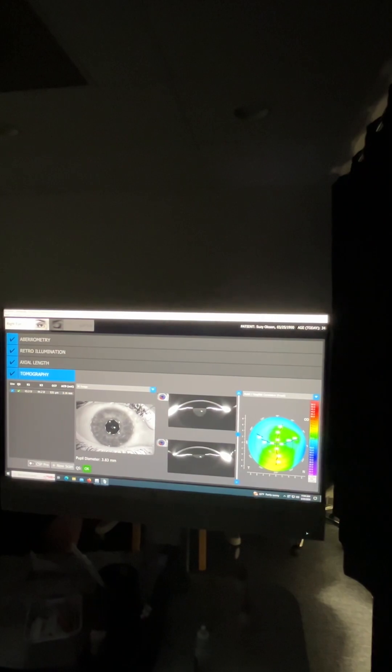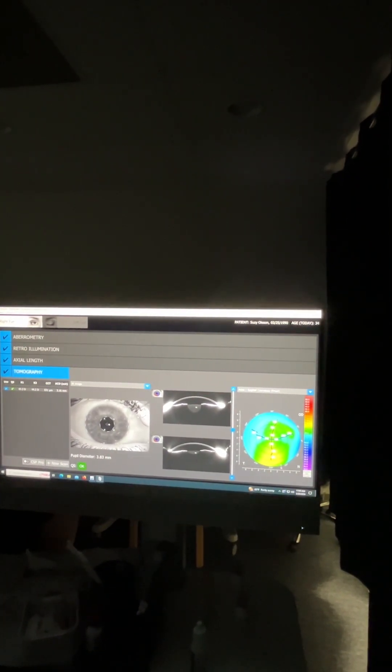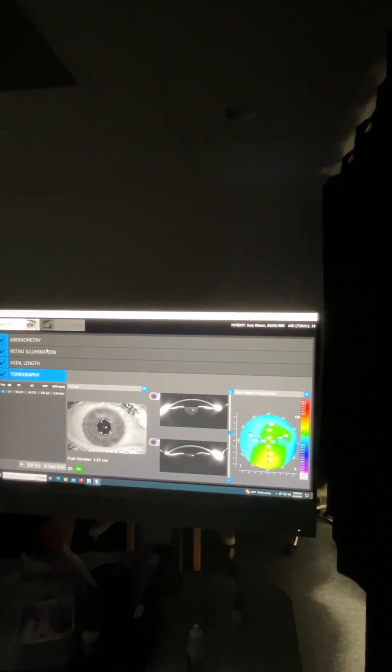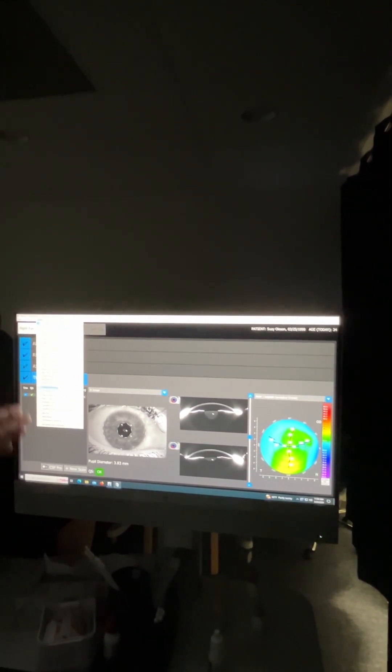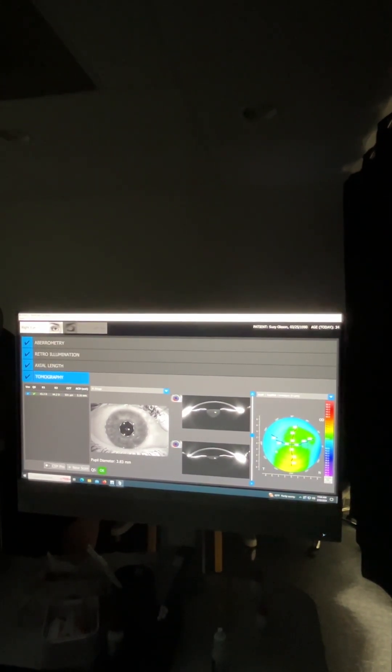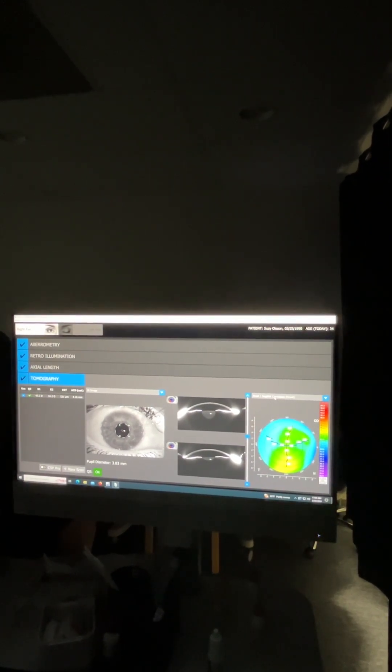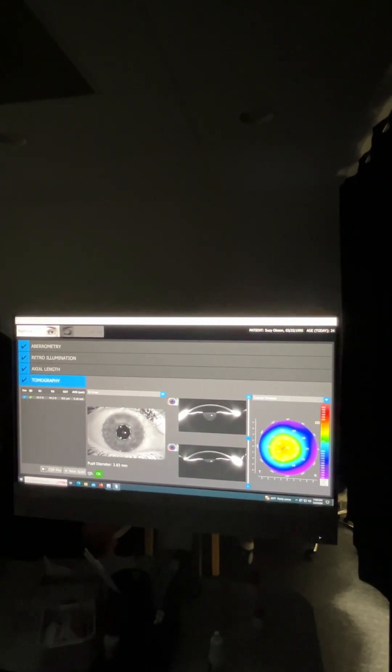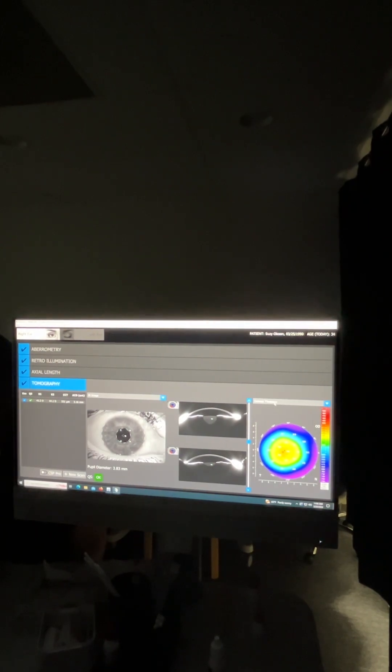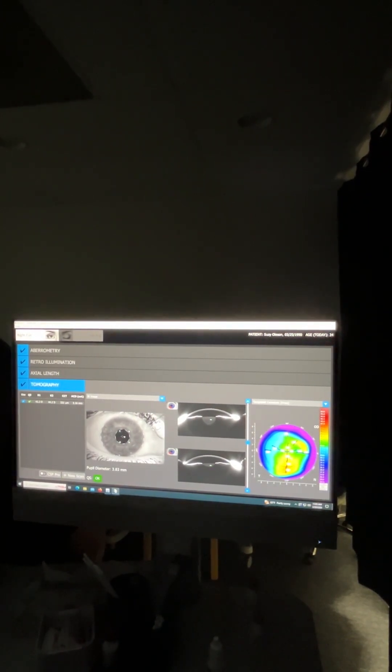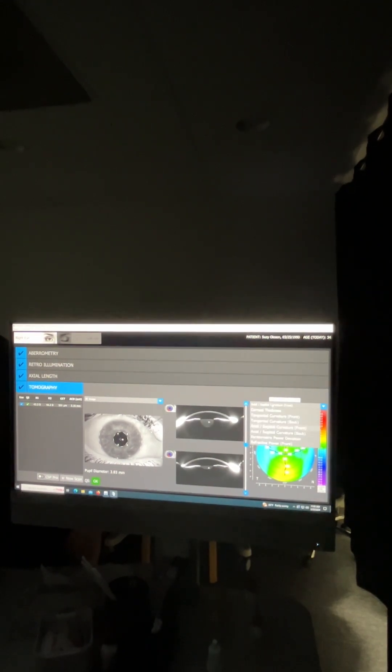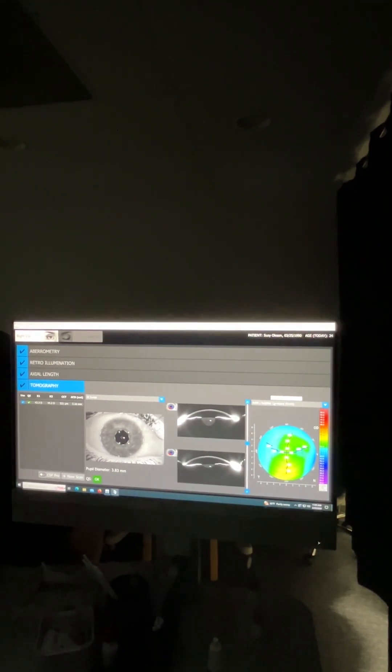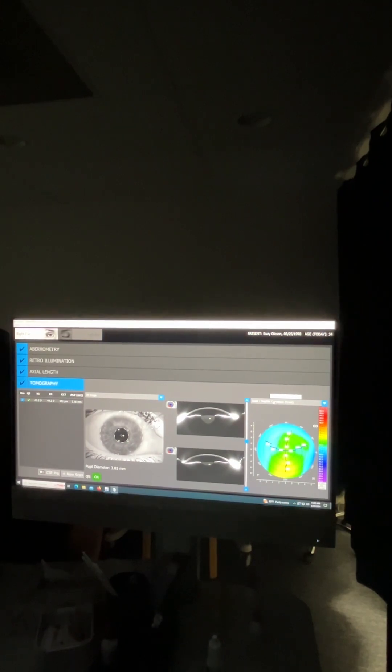To the right is going to be your maps. It's not all of your maps. If you want to review all of your different maps, you would go to display settings and there's a variety of display options you can look at in more detail, but it'll give you some of your main ones, your corneal thickness map, your tangential curvature map, your axial curvature map. These are some of your most common ones.